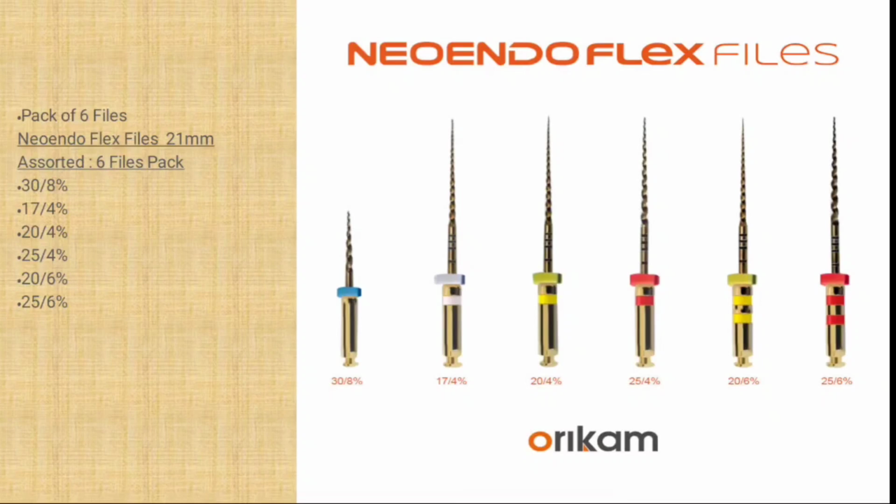So we know that it is blue. The purple file in hand files is number 10, then the white is number 15, and the yellow is number 20, and then the red is number 25. So the markings are accordingly; you don't have to remember, the color coding is the same as the hand files. But for the tapers, how do we know how much taper it is?